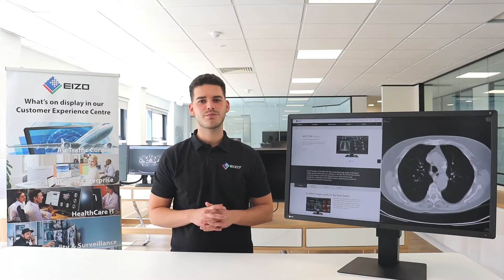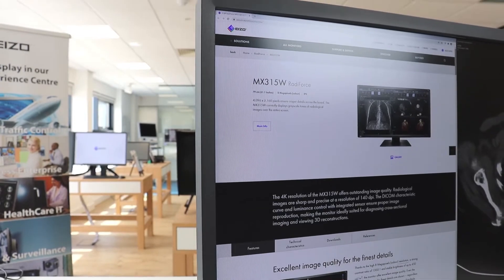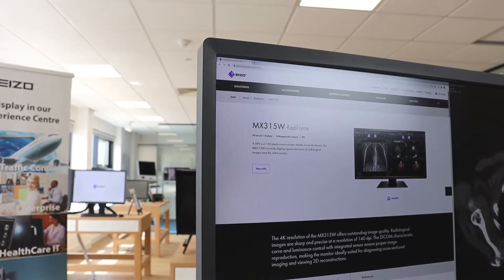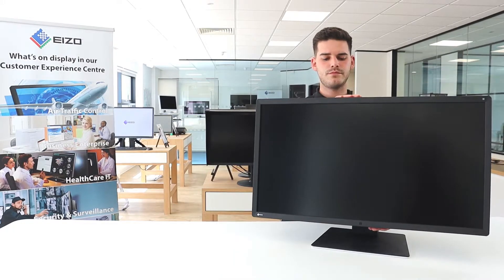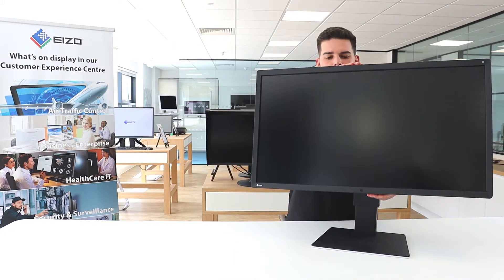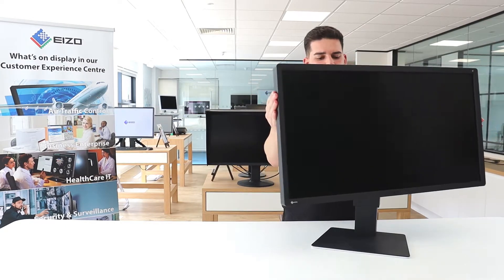Narrow black frontal bezels make the MX315 ideal for use in dark environments, making it easier to visually concentrate on the display. The base allows the monitor to be height adjusted, tilted and turned. Despite its maximum movement possibilities, the flex stand base always remains completely stable.